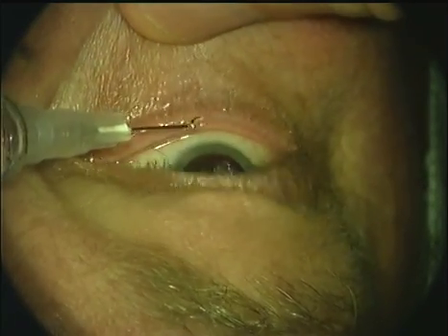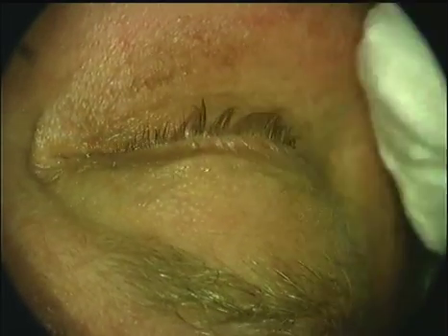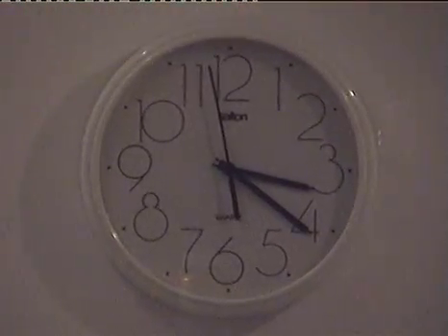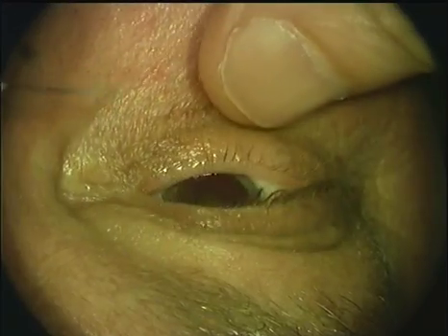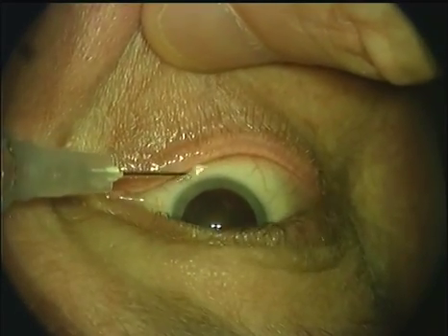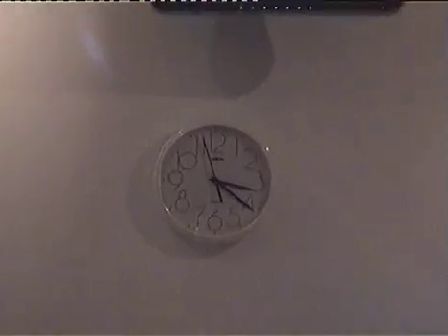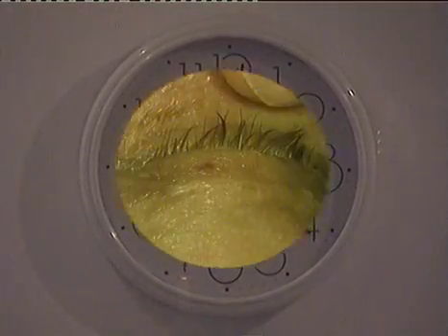A few drops are dribbled into the lower conjunctival fornix and we then wait one minute. The process is then repeated and we wait a further minute. I insist this is by the clock because when we commence our training we tend to be anxious and impulsive, and this can lead to problems. A third lot of drops are instilled and by now we're getting pretty good conjunctival anaesthesia.